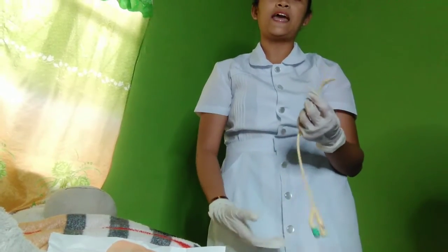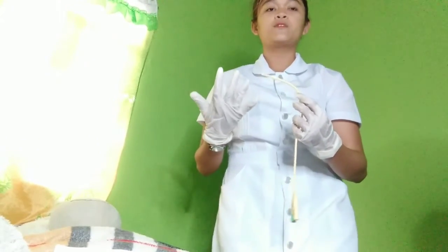So pick up the catheter with the sterile dominant hand, 7.5 to 10 cm below the tip of the catheter. Holding the catheter closer to the tip will help to control and manipulate the catheter during the insertion.